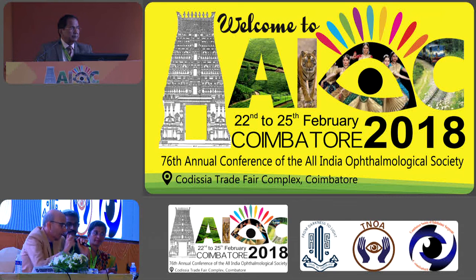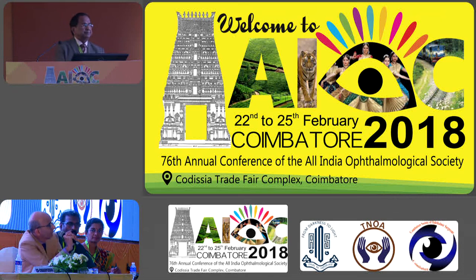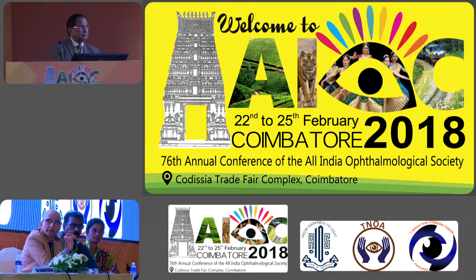So I think we are now coming to the end. If you have any questions or comments, this is the time. But we ran through this technology, helping us, the surgeons, in terms of the energy dissipation, the controlled environment with these machines during implantation, using the right understanding of the multifocal lenses and these LensX. So I think we have many things now at our disposal to consider and adapt whatever one can under realistic circumstances. So thank you so very much for your patient hearing.